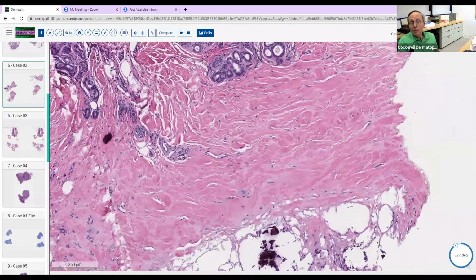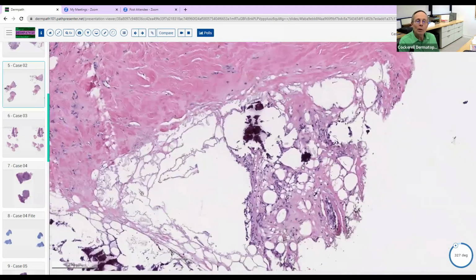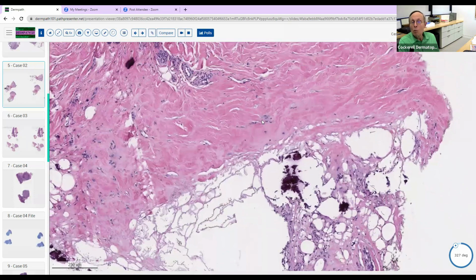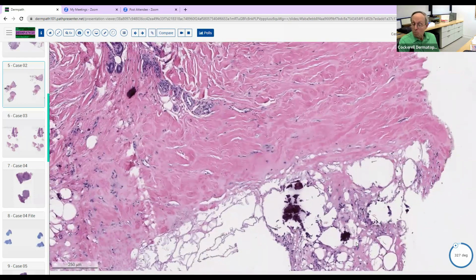So it's a very interesting biopsy. I think the most important teaching point is just to understand when you see this sclerotic collagen, to have a differential diagnosis of things that hone you into that. You probably would not see something like this on the board examination because it's too esoteric, but it's an interesting example of morphea where there was also morphea panniculitis that was more lobular with dystrophic calcification.